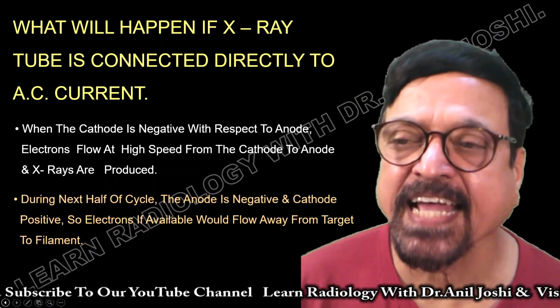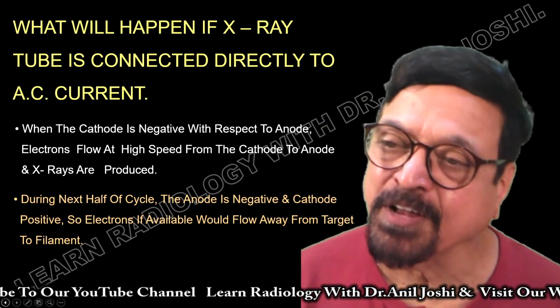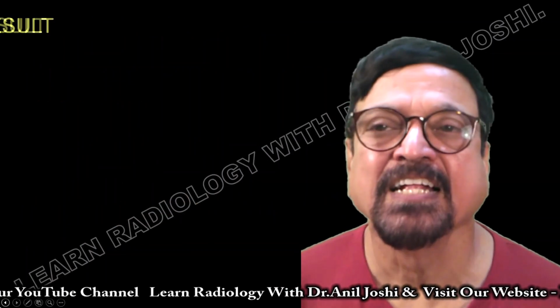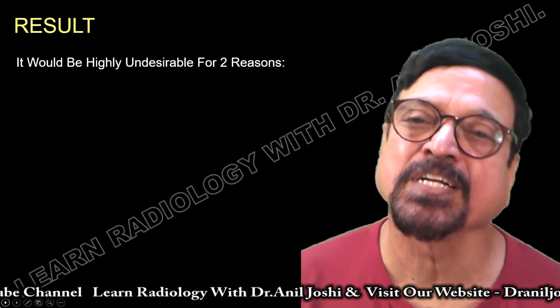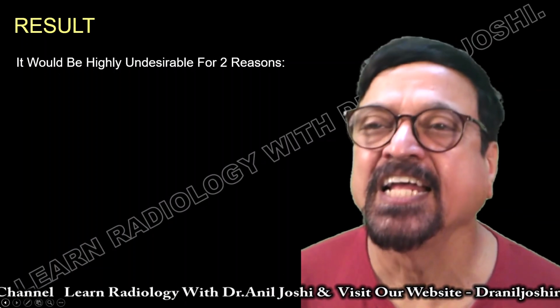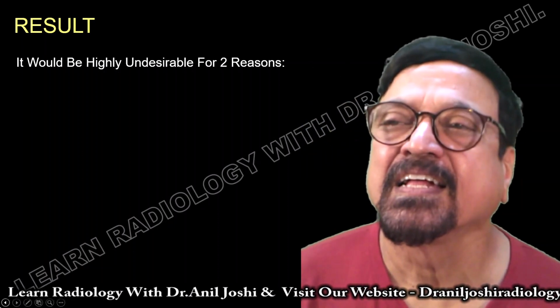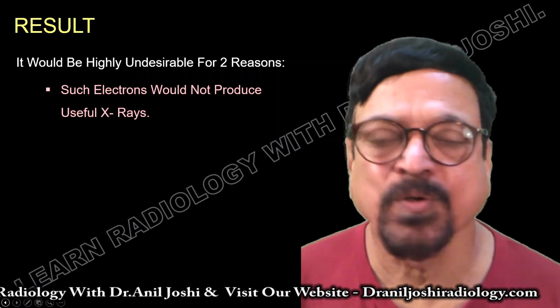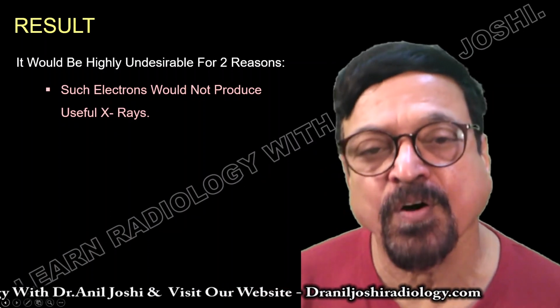During the next half of the cycle, the anode is negative and the cathode is positive. So electrons, if available, would flow from target to filament. In that way, we will be using only 50% of the electric potential. It would be highly undesirable. Such electrons would not produce a useful X-ray, or even if they produce, they will not be of uniform quality.